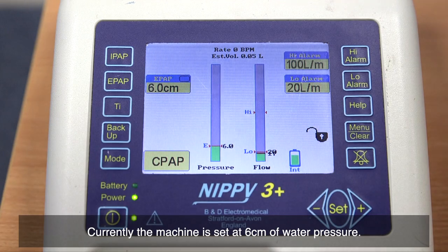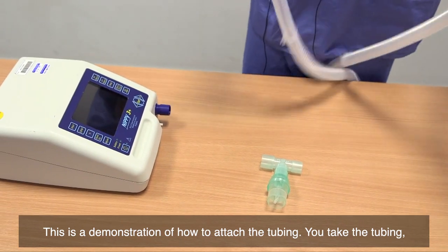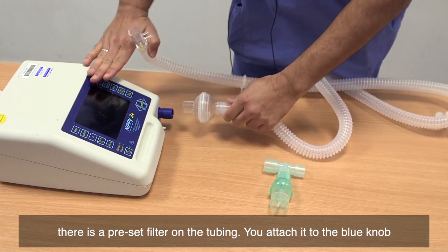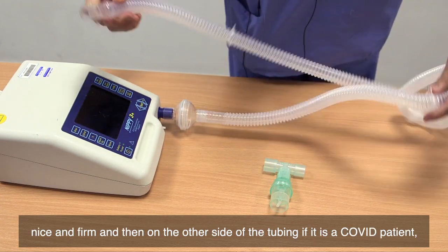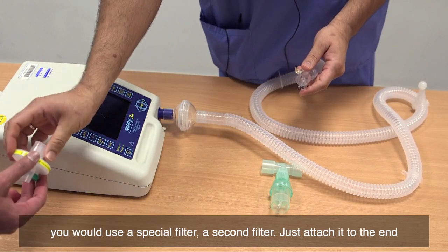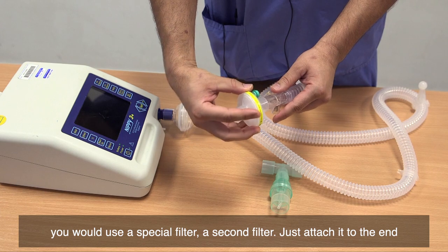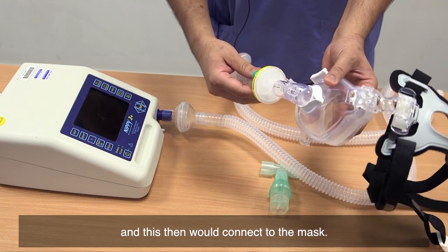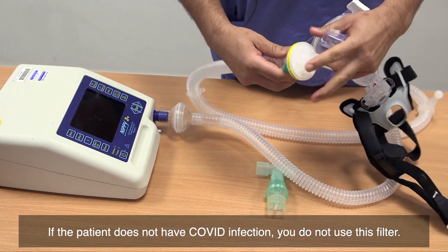This is a demonstration of how to attach the tubing. You take the tubing — there is a preset filter on the tubing — and attach it to the blue knob, nice and firm. Then on the other side of the tubing, if it is a COVID patient, you would use a special second filter — just attach it to the end, and this then connects to the mask. If the patient does not have COVID infection, you do not use this filter.